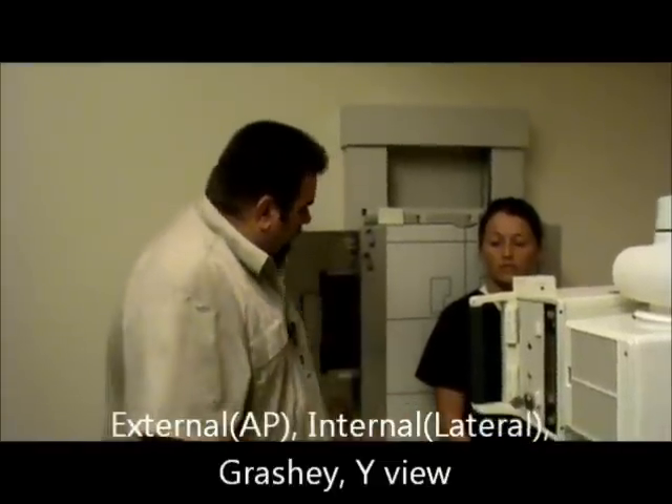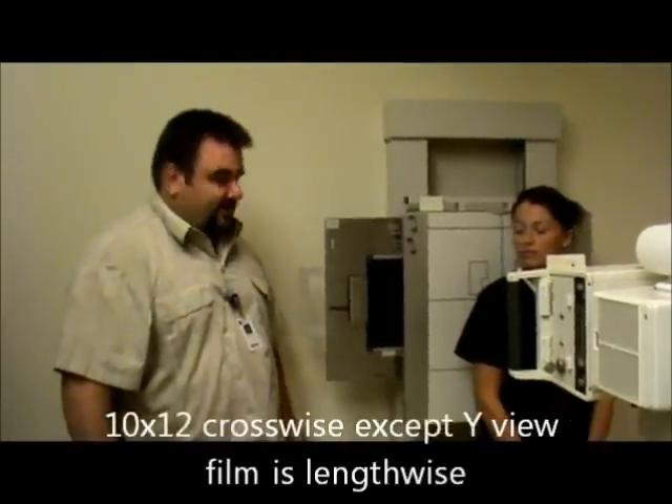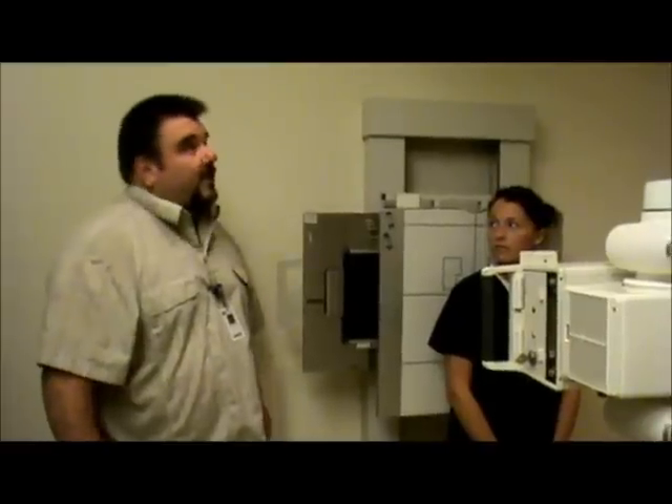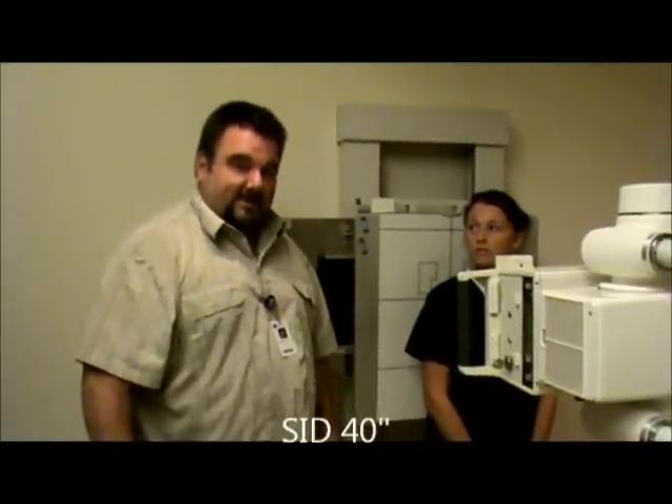We're going to use a film size of 10 by 12. For the internal, external, and Grashey views, we're going to have it crosswise. For the Y-view, we're going to turn the film lengthwise. Our SID is going to be 40 inches. Our technical factors for the internal and external are going to be 77 to 81 kV, automatic exposure control, and it will be center cell.